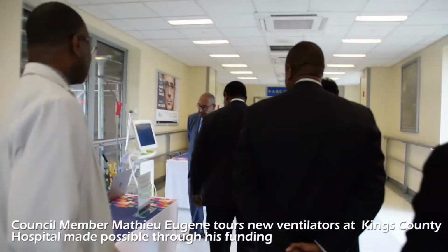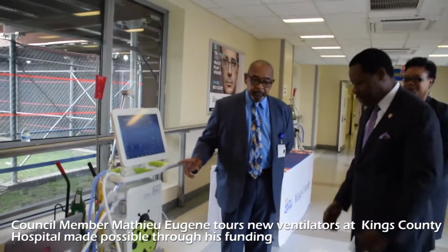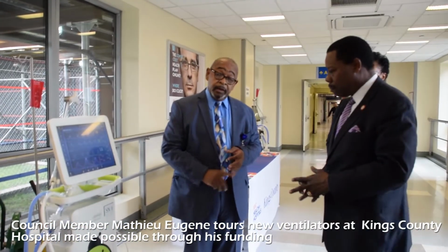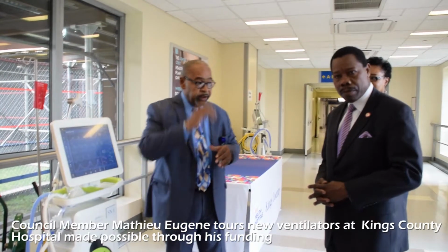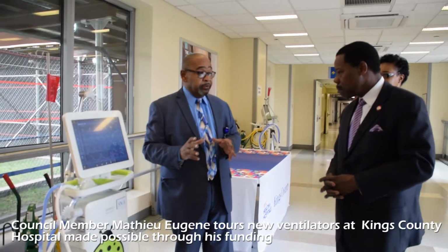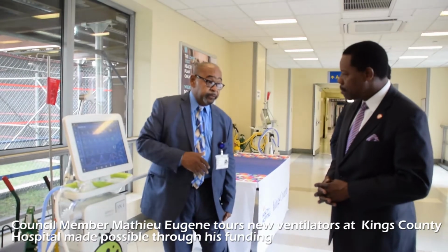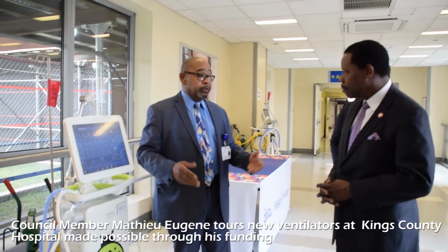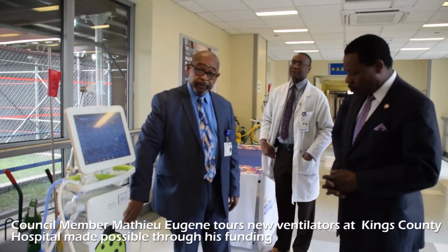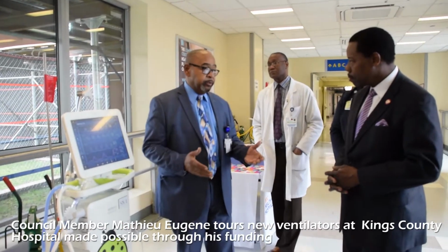For our neonatal unit, I can show you. You can see it's totally different. Yeah, it looks different. This machine was designed exclusively for use on neonatal and pediatric patients, as opposed to the other one, which can ventilate any patient population: neonate, pediatric, or adult. But neonatologists don't like ventilators to go back and forth between adult units and the NICU, because babies, for the first 6 months, are pretty much existing on their mom's immune system. So they're very vulnerable. These machines will stay in the NICU only. They do have some application for pediatric patients.